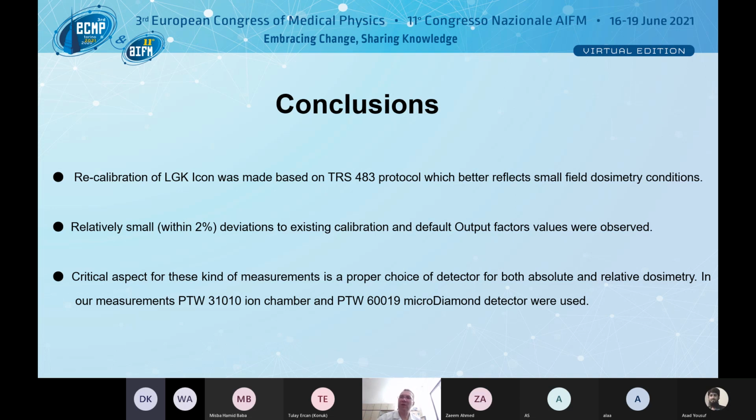You should not see big changes in terms of absolute dose calibration, and if you pick the correct detector, I suppose you should find very good agreement in the case of gamma knife with Elekta calculated numbers. It's not just my measurement, but there were several measurements published, presented, independent Monte Carlo calculations.